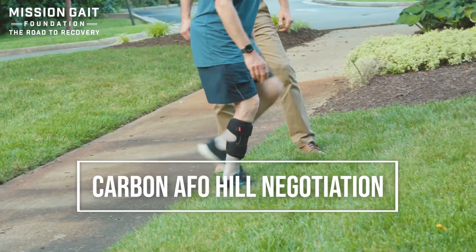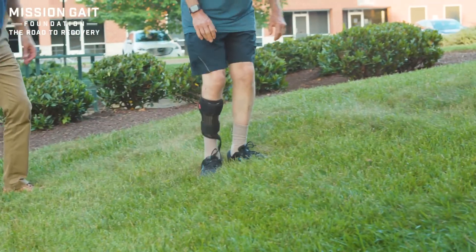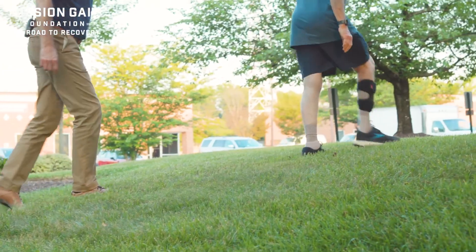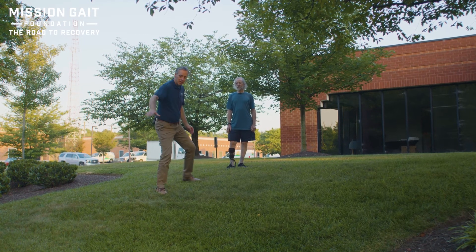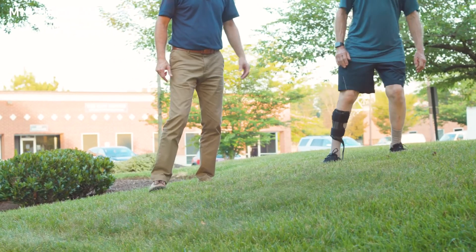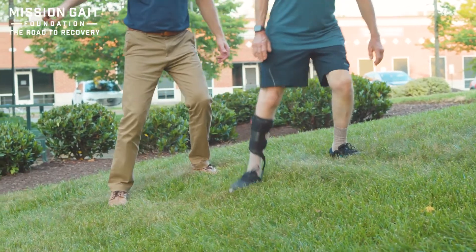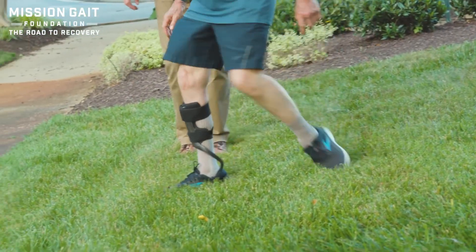So let's try that — be strong. Heavy on that foot, turn sideways and don't cross over — just sidestep up the hill, pressing into the ground hard. Then turn and walk away. Coming to a steep grade, simply turn, keep that prosthetic or orthotic on the low side, and sidestep down. Be very aggressive about how you press into the ground. Press hard in the instep of the foot so it doesn't topple you. When it starts to get level, you can turn and walk away. The steeper it gets, the more it wants to topple you down the hill, so step out, dig into the instep, take a little bigger and wider step each time.